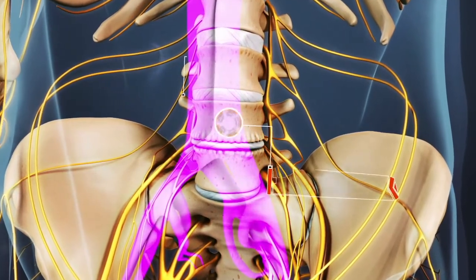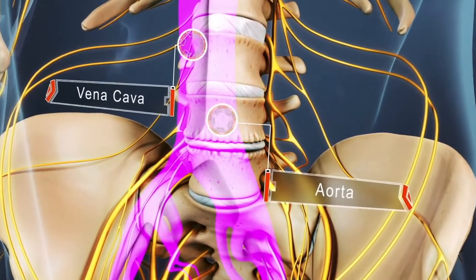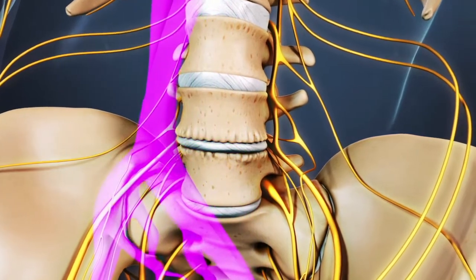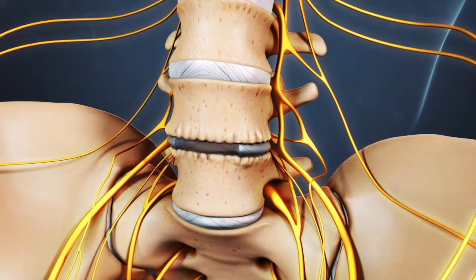The large blood vessels, called the aorta and vena cava, lay on top of the spine, so a vascular surgeon will usually be part of the surgery to move the large blood vessels to the side. After the blood vessels have been moved aside, the disc material is removed.